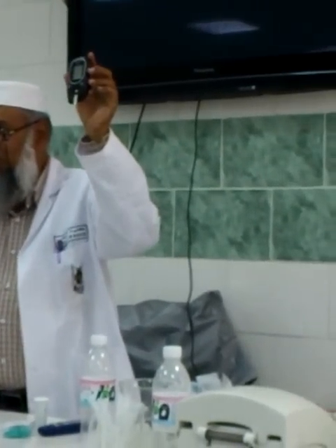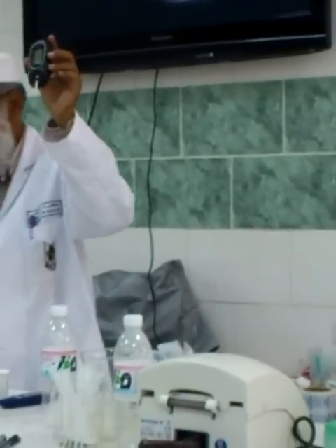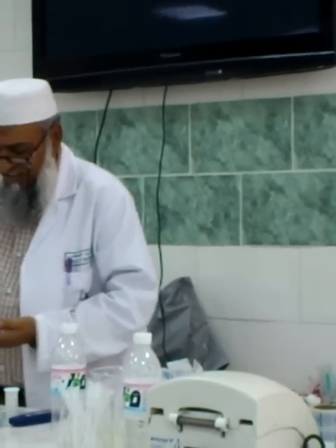Okay, now you see that before exercise it is 522 milligram. Very high level. Huh? Now let's see after exercise how much the glucose level comes back.